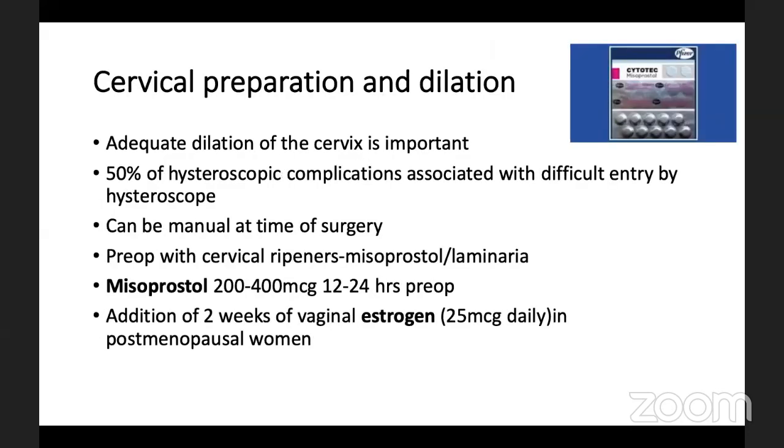This has been discussed quite extensively by Dr. Tim Kundojiwa, so I'm just going to go through it quickly. I just put up a slide on cervical preparation and dilation of the cervix as part of hysteroscopy. Adequate dilation of the cervix is important, but if it's stenosed and you over-dilate it, then you may have difficulties retaining your fluid in the endometrial cavity.